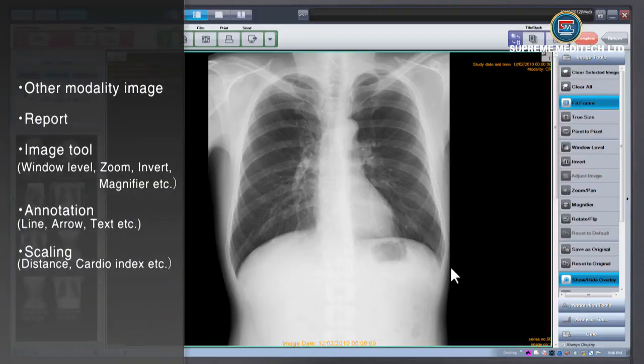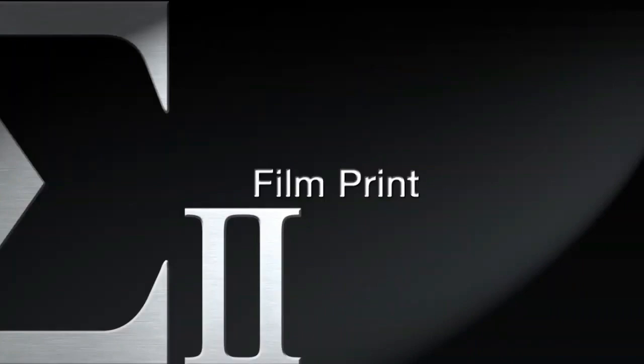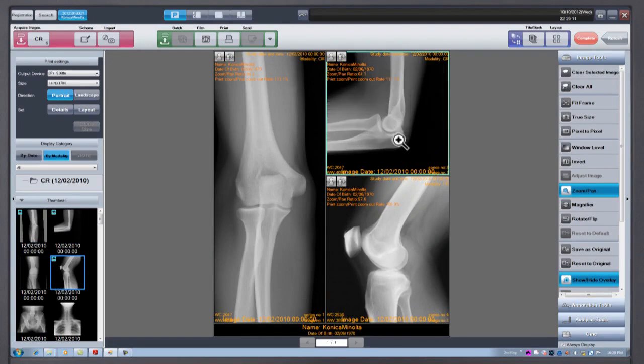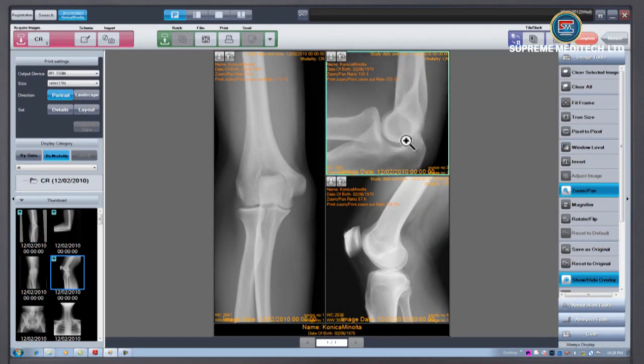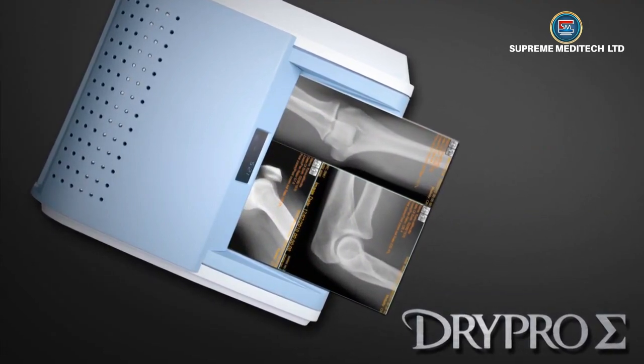Image Review: ImagePilot supports many features and functions for image review. Film Print: The ImagePilot has a print composer mode where one can adjust images, layouts, and annotations freely. Printing can be completed quicker and with more economical use of film.